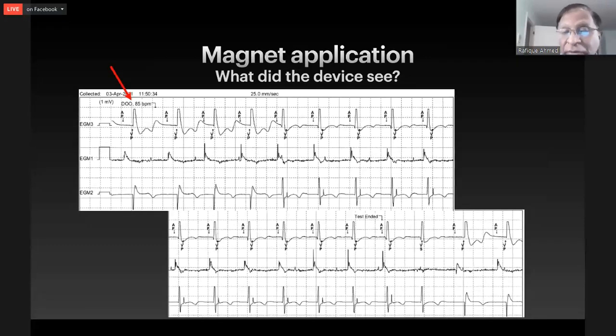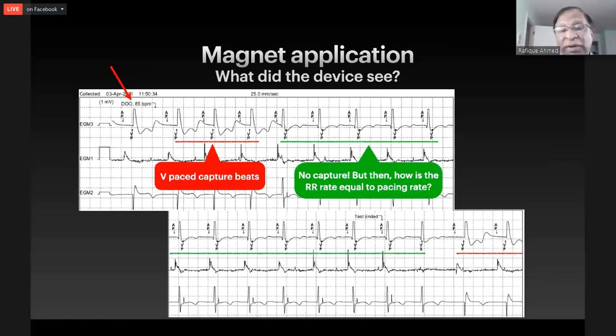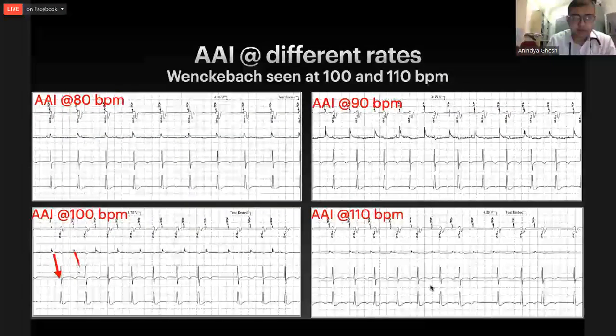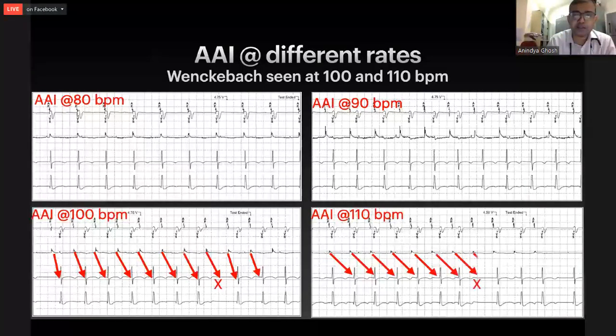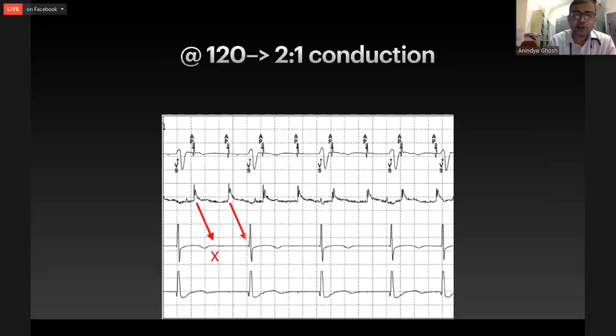I mean, two possibilities. One, that you had retrograde Wenckebach, and when the retrograde penetration did not happen, that's when it can conduct. The other is maybe there is a possibility of dual pathway in the AV conduction, so that one is blocked, the other conducted. Nevertheless, this was refuted by the atrial pacing. We did only atrial pacing, and it was driving. So this was ruled out.